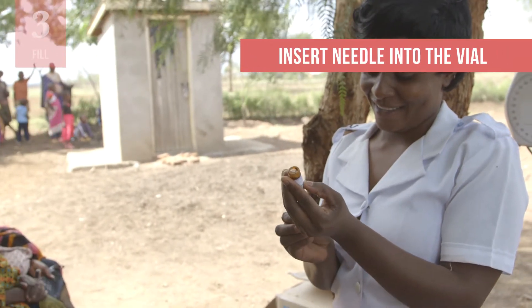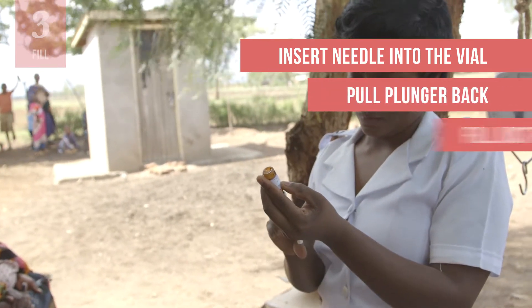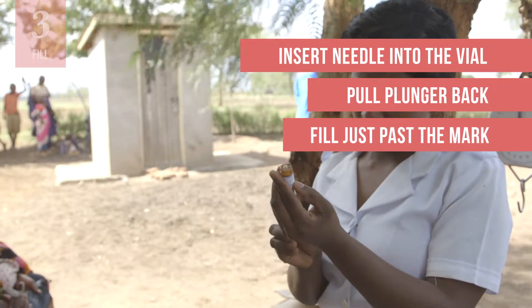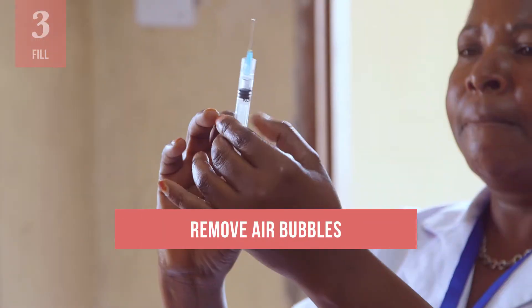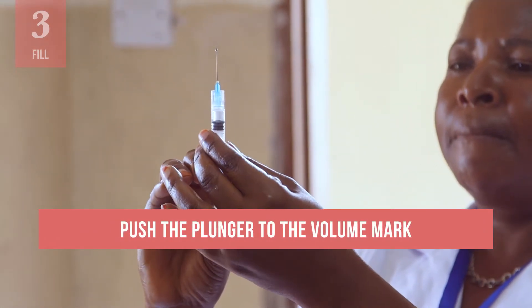Its tip should be in the lowest part or bottom of the vial. Pull the plunger back to fill the syringe just past the mark. Remove the needle from the vial or ampoule. Remove air bubbles by holding the syringe upright and tapping the barrel, then carefully push the plunger to the volume mark.